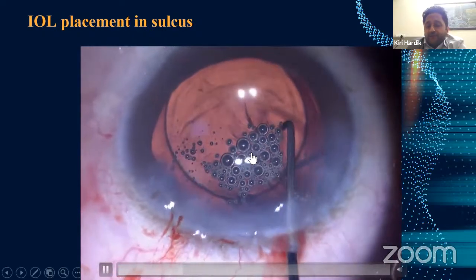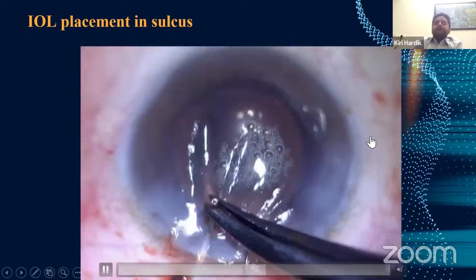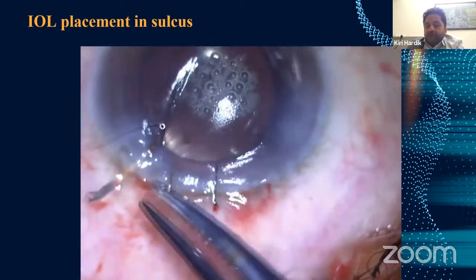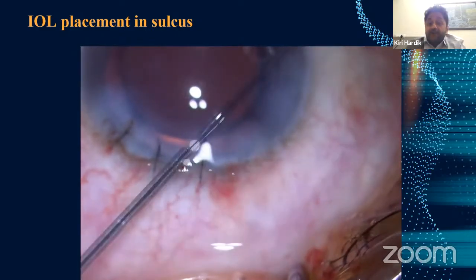So depending upon the situation, you have to plan for the intraocular lens implantation. You can do a pupillary capture there, and always put a suture over your wound, because by putting the suture, your wound will not leak and definitely chances of infection are also less. Particularly if a second surgery is planned, in case where there is a nucleus fragment or nucleus which has dropped, or if the patient is aphakic or there is an IOL drop, there may be a need again to give a peribulbar block or something.